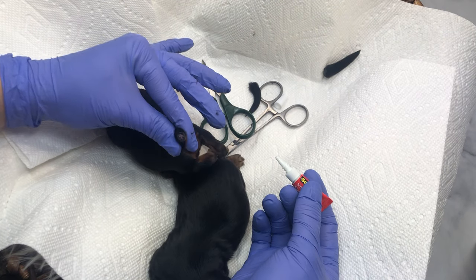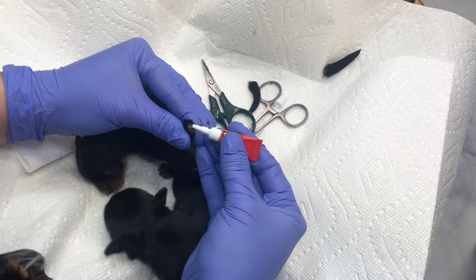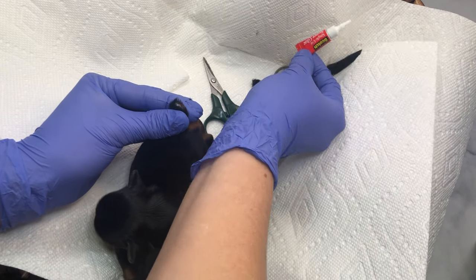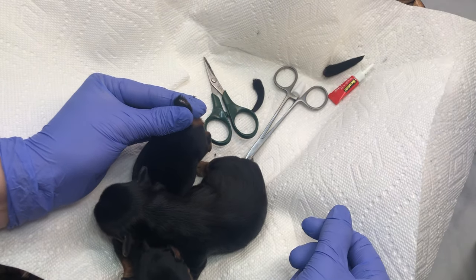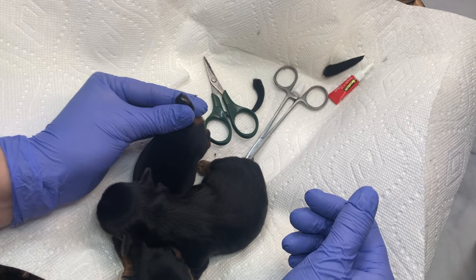No biggie. You can kind of see that it's open a little bit. Now we're just going to put a couple daubs of super glue and just hold that for a second. Give that a little bit of time to dry. Not as big a deal as some people make it out to be.